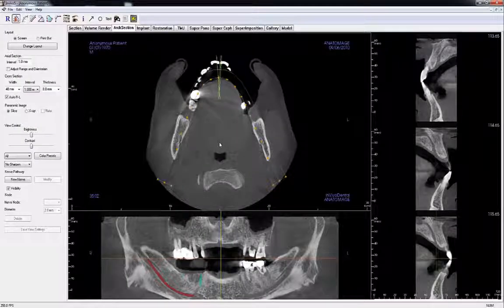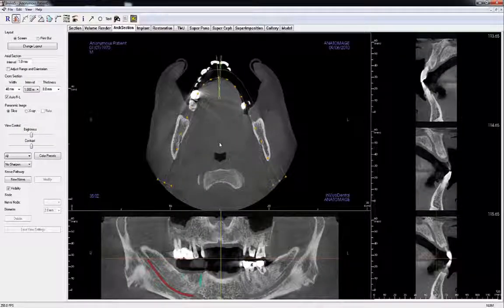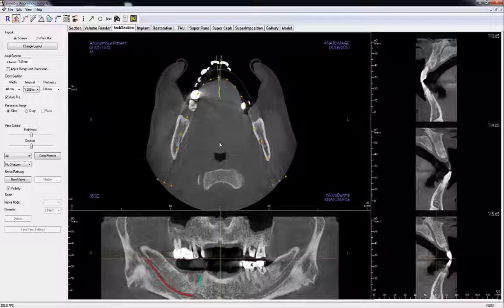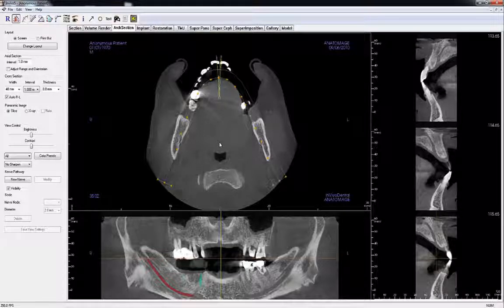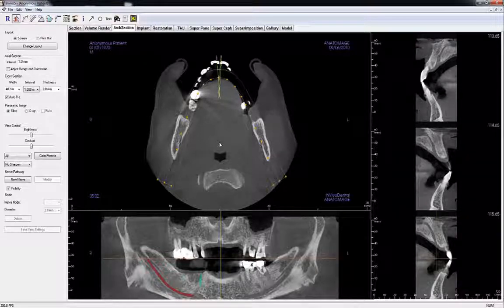The purpose of the Arch Section tab is to create a panoramic image for tracing the inferior alveolar nerve in mandibular implant cases and generating good cross-sections for making accurate measurements.